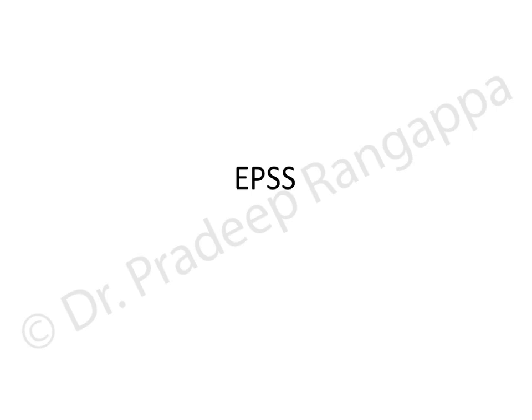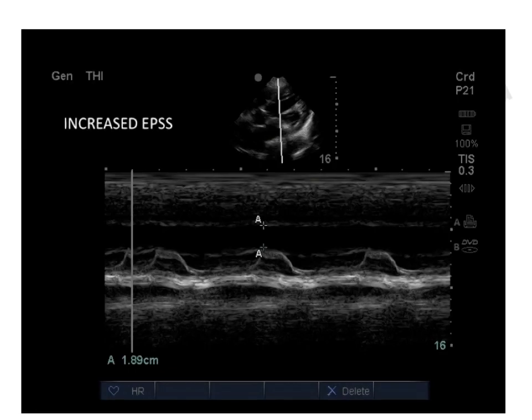And if an intensivist has to do ejection fraction either by using Simpson or fractional shortening, it would take time. And in intensive care, we want a very quick assessment of LV and to have a number put to that LV. So for that, I think EPSS is a good modality for intensivists to put a number to the ejection fraction. So EPSS is simply E point septal separation. So that is what it is. It's a very simple tool.